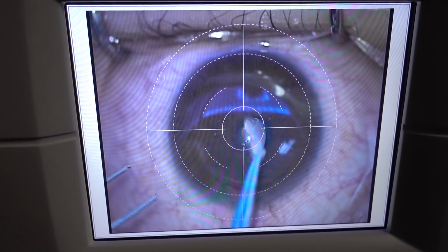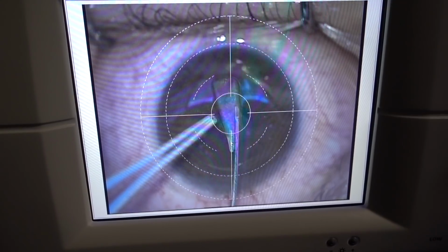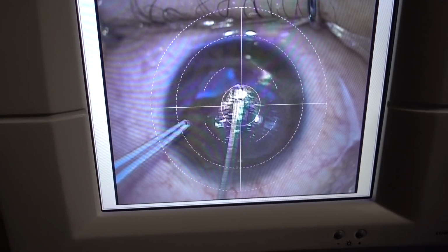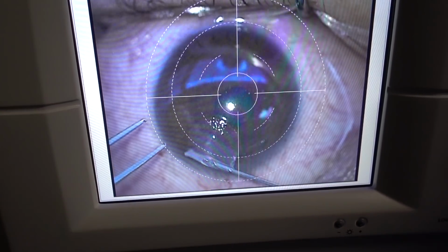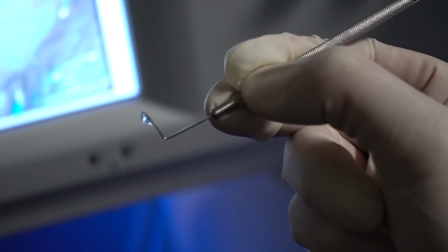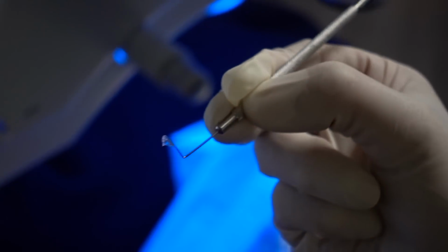And what did you see there? Oh. That's the prescription. We just removed the tissue from inside. We just delivered the baby. And now we're checking to make sure it's completely, perfectly round. See how it's nice and round? That we got all of it. So that was the problem. That was the problem. That's why she had to wear contacts. So this is her contact lens. That right there. Mm-hmm. Wow. Interesting, huh? That is amazing.